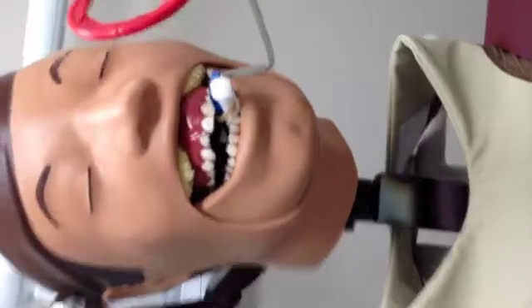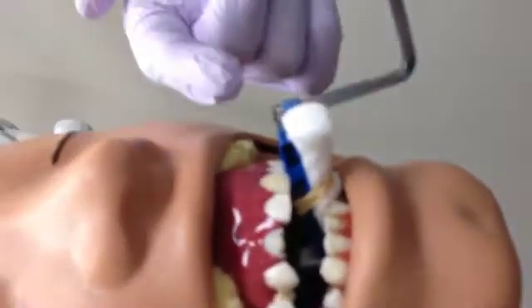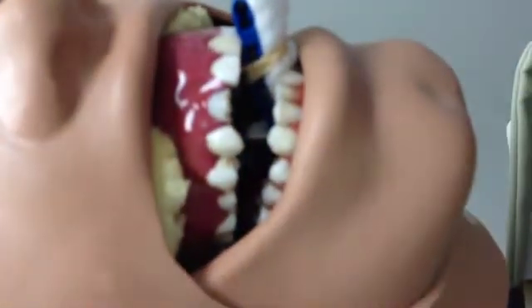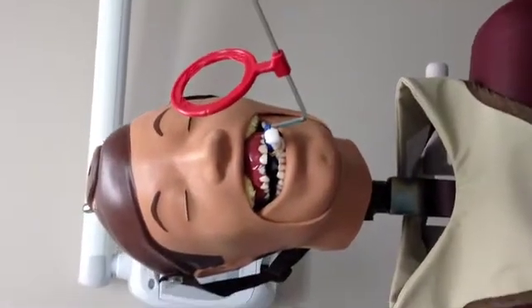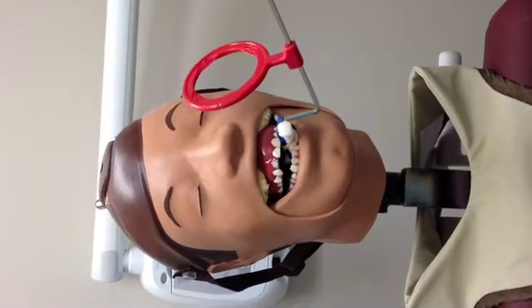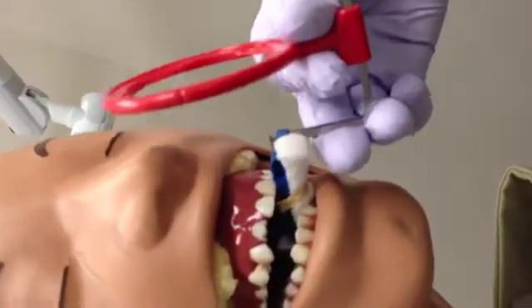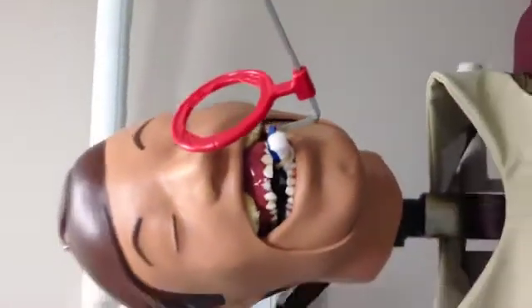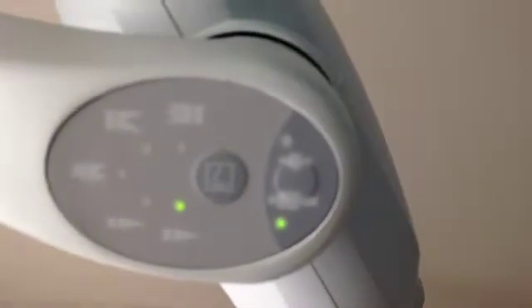Have the patient bite down near the end of the bite block so that the plate is back in the mouth instead of right behind the tooth. Inform the patient to move as little as possible to prevent blurring of the image. Once your patient has bitten down, move the ring to approximately 1 inch from the patient's face. Make sure the X-ray unit is set on the anterior setting, adult or child, and on the computer.